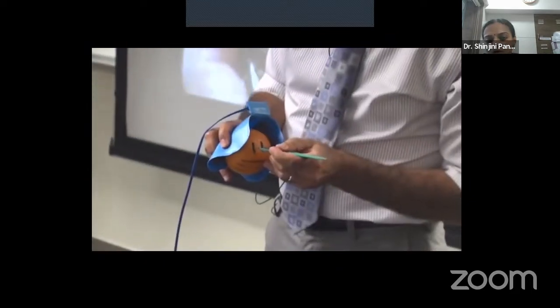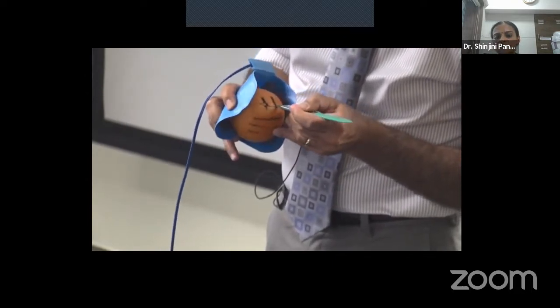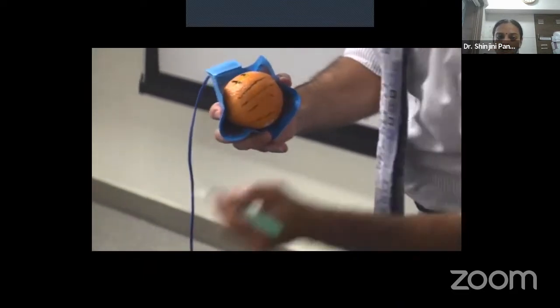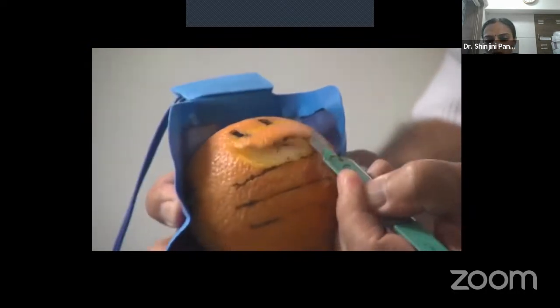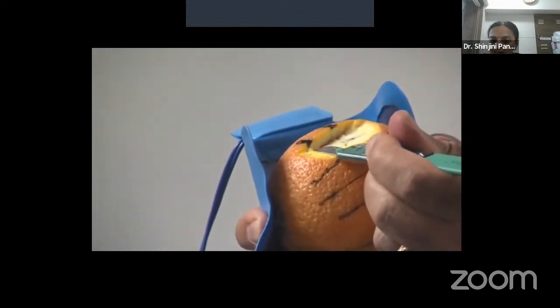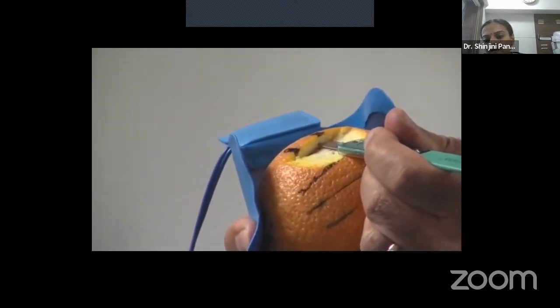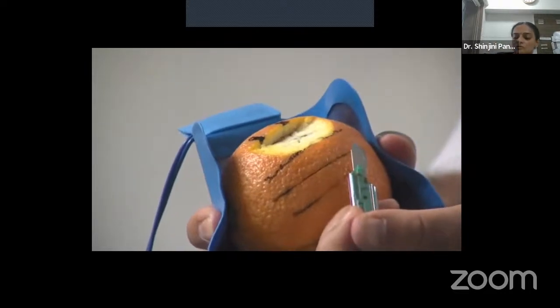But when you cut the tissue out to see what is the depth of penetration, you will find, see the demonstrator here is cutting the orange. And once you cut the depth, you will see that the yellow waveform actually penetrated deeply to coagulate the vessel completely, while you can see that the other one sparked all over in the air. But can you see the depth of penetration? It is very, very less. So this is how you should understand electrosurgery, and this is how the blue current, the blue mode works.